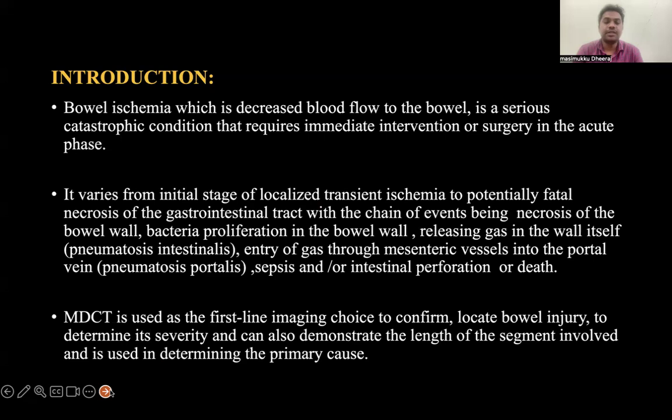MDCT is used as a first-line imaging choice to confirm and locate bowel injury, to determine its severity, and can also demonstrate the length of segment involved and is used in determining the primary cause.